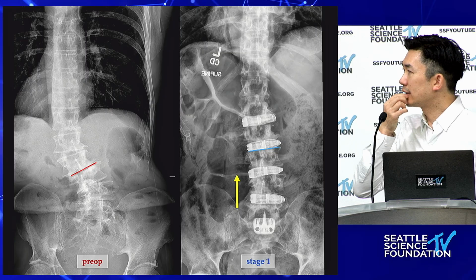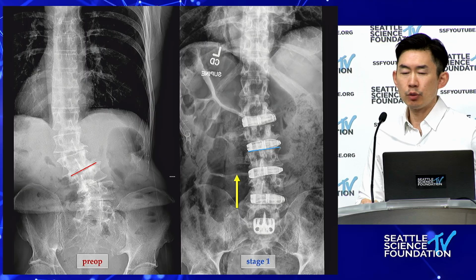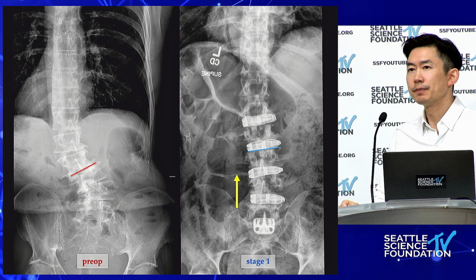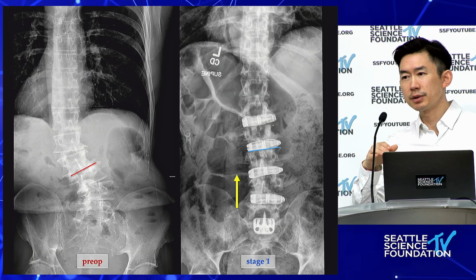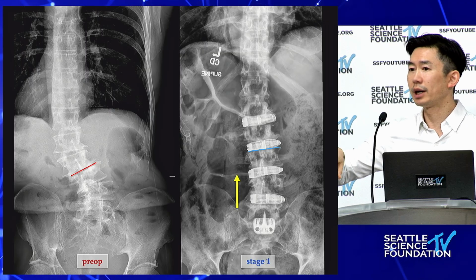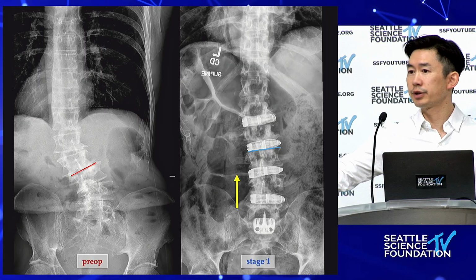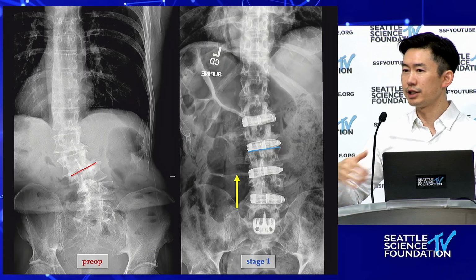Yeah, I think the great thing about the lateral course is there are so many ways to do lateral surgery. Again, my introduction to lateral surgery was straight to OLIF. And I think with the OLIF retractors, typically there's more leeway to see because you have the anterior psoas, and so I cut underneath the psoas and I make sure the annulotomy is very wide. My annulotomies are essentially from the anterior 25% all the way back past to the posterior. By that large release, I feel like I get more of a discectomy, at least in my own hands.